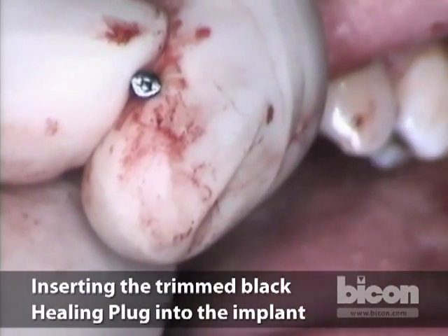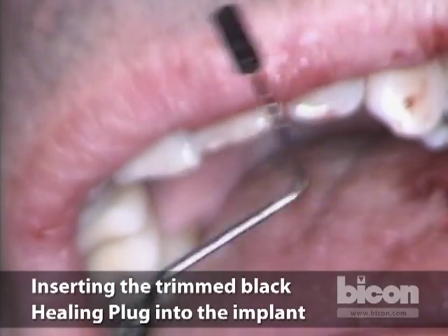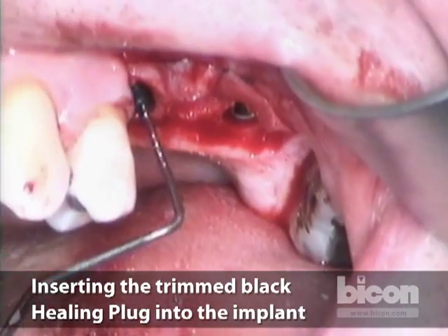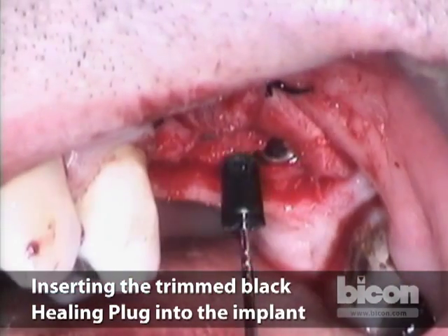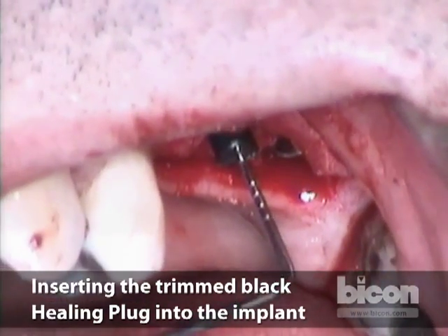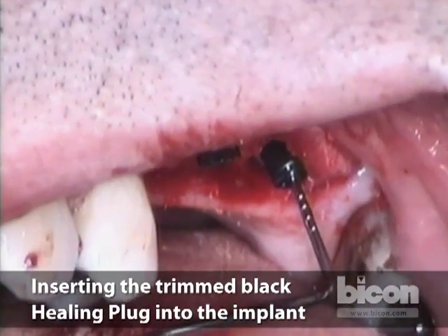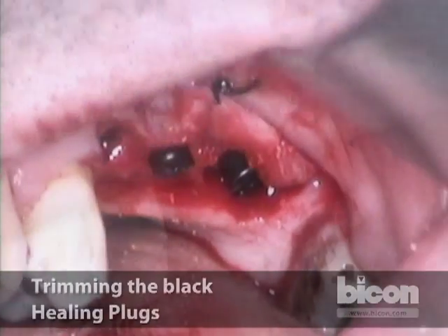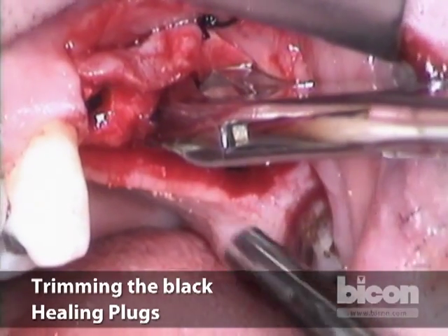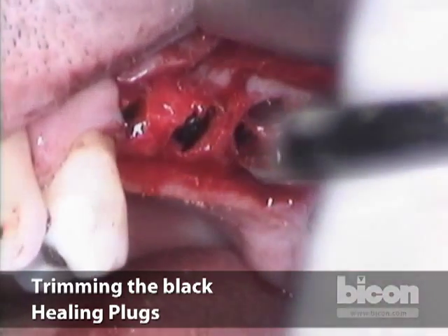To seat it in place, there is a little hole right inside the center of the healing plug. We'll introduce a perio-probe. First with the first molar. Now both of these appear a little bit longer than I want them to be, so you can adjust them intra-orally using the cutter.